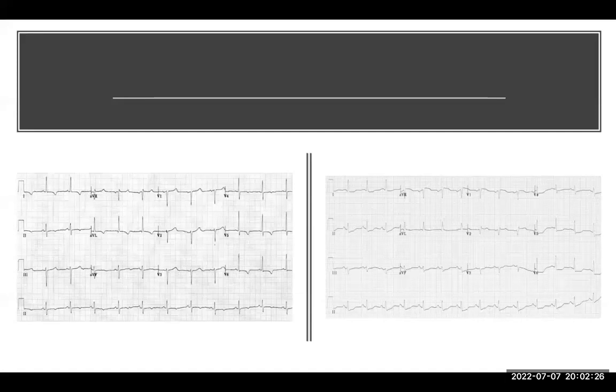If you have ST segment depression in 1 and AVL, it does not mean that there is ischemia in the lateral wall. No, it's just telling you that there is an area in that part of the heart which is starved of oxygen, but the muscle is still alive, that it is partially blocked. And this is where you do your cardiac troponin, and you distinguish as NSTEMI or unstable angina. If there are non-specific ST and T wave changes, and the troponin is high, you call it NSTEMI.